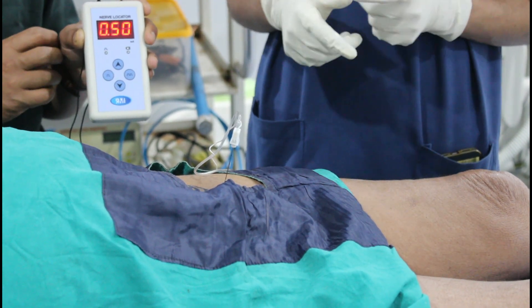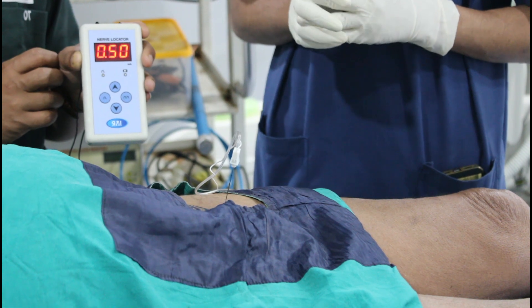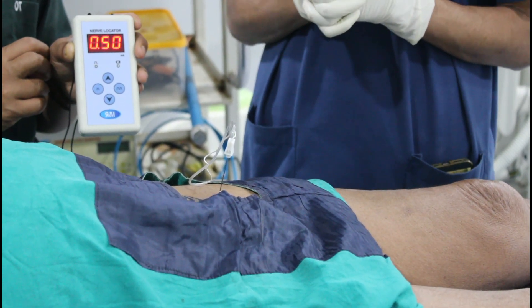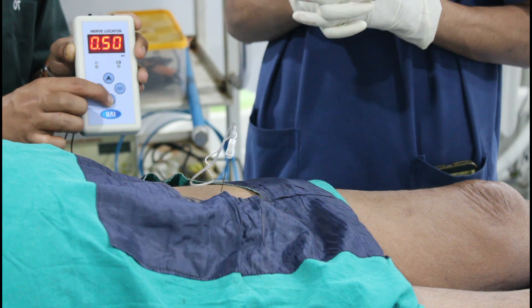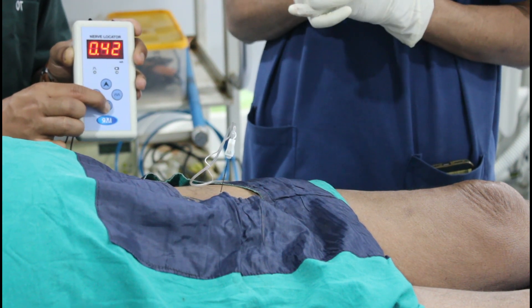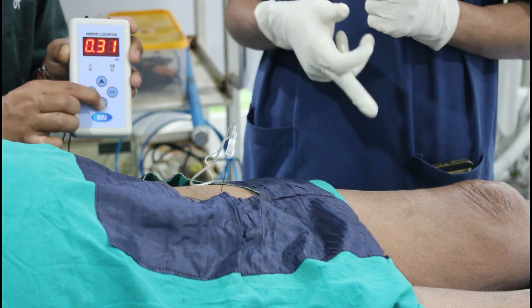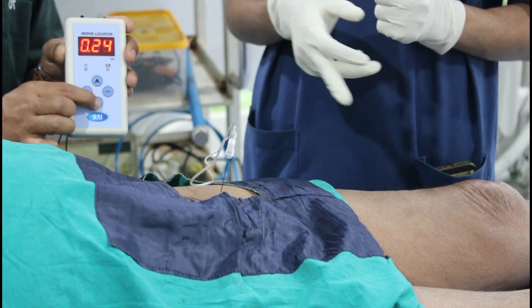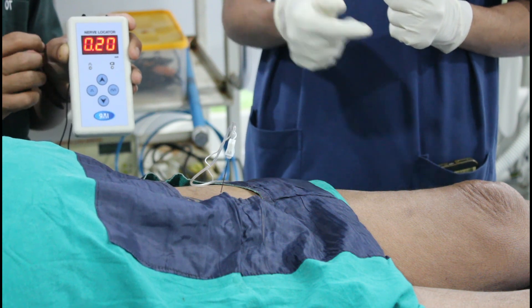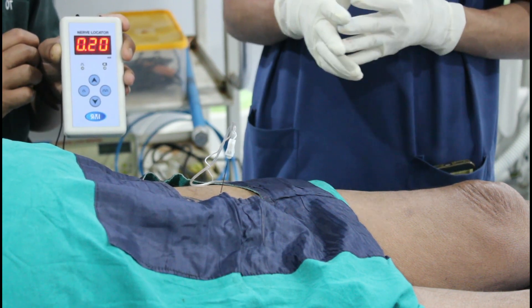At 0.5mA current also I am nicely getting the adductor longus muscle contraction. So I will go down to 0.2mA current and I will check whether my needle is outside the nerve bundle or inside it. You can see at 0.2mA current my contraction has disappeared — I am not getting any muscle contraction.